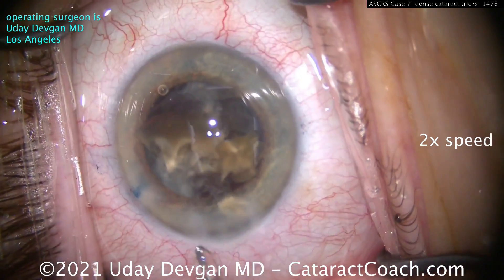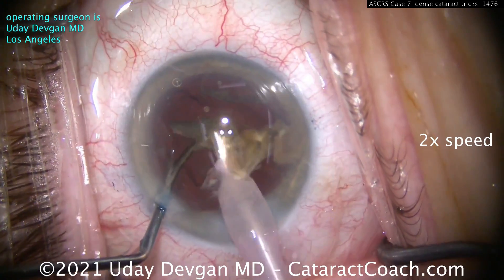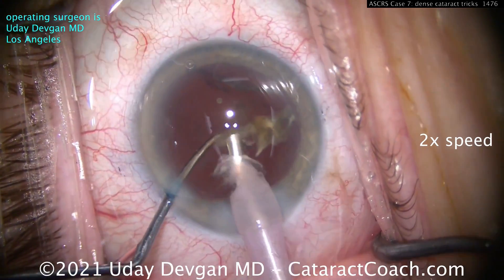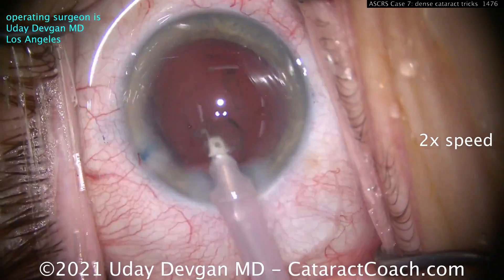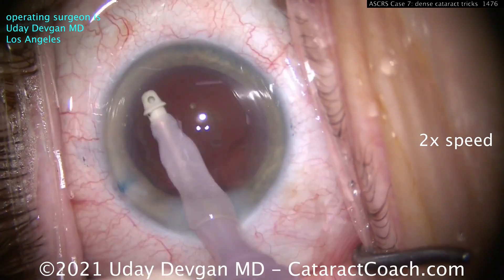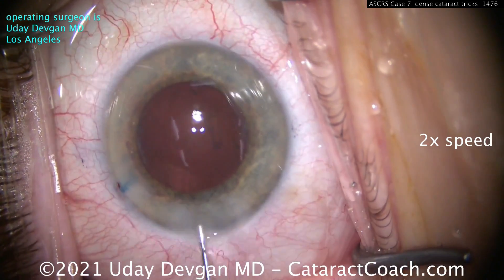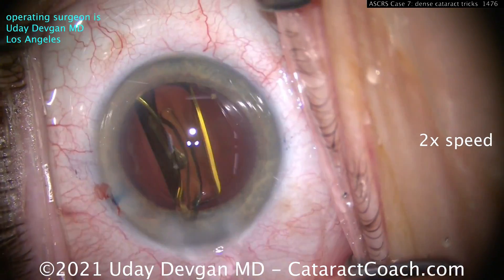Notice how I also recoated the endothelium with viscoelastic multiple times. Use a good viscoelastic to protect that cornea. We also want to use good phaco power modulations. You can't just use continuous mode — you should use a burst mode or a pulse mode. If you don't know the difference, go to cataractcoach.com, not just YouTube, and learn about that.